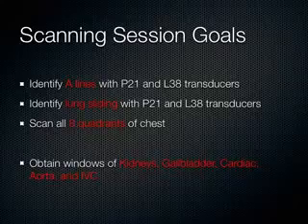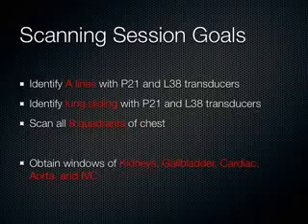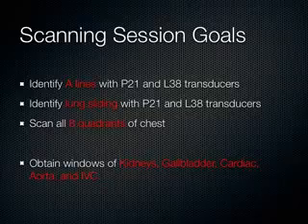The P21 probe is a cardiac probe. You can see deeper, and the pleural line is going to be way at the top of the screen, so it's not going to give you the detail, but it gives you also an idea of whether any B lines are better seen with the P21 probe. So go back and forth between probes, but for pneumothorax, you definitely want to use the high frequency probe.